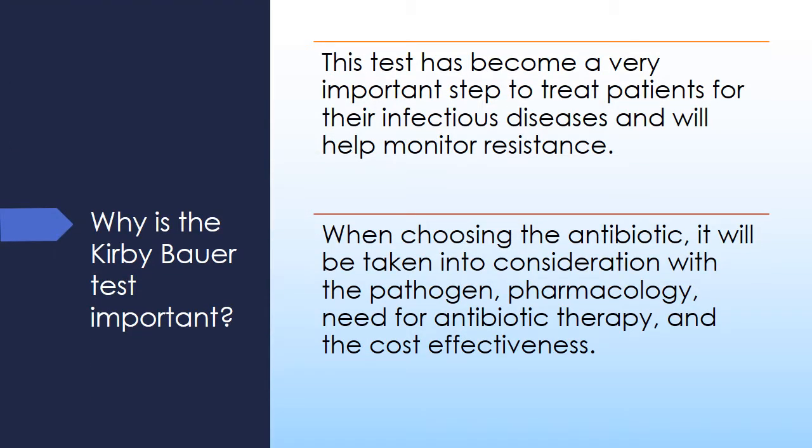Why is the Kirby-Bauer test important? This test has become a very important step to treat patients for their infectious diseases and will help monitor resistance. When choosing the antibiotic, it will be taken into consideration with the pathogen, pharmacology, needs for antibiotic therapy, and the cost effectiveness.